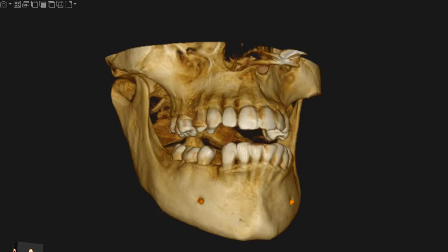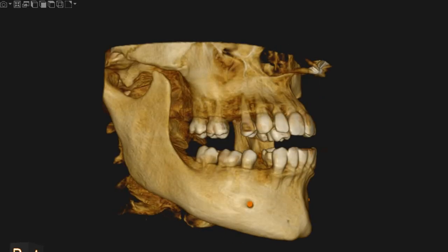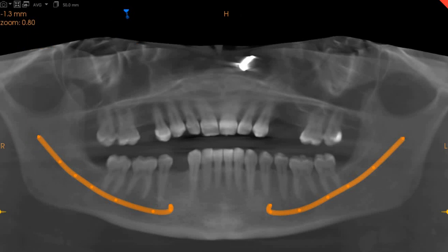Assalamu alaikum. Ultra Scan Diagnostics here. This is the CBCT of the patient that you had requested. The area of interest is implant placement in the upper right five, upper left four and five, and lower right four regions.